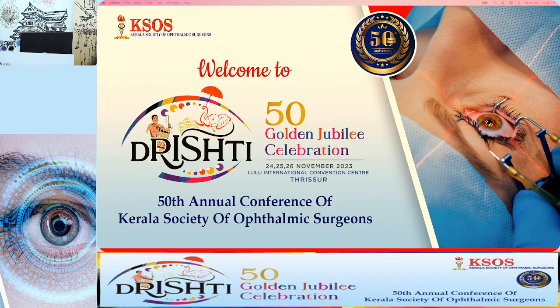Thank you, Dr. Nishi, for the concise presentation of an elaborate topic. I would like to emphasize that you should not interpret a single field in isolation. You have to take 2 to 3 fields, and the findings should be consistent, and they should correlate with your disc findings. Then only you can say that a field defect is present or not. Thank you.